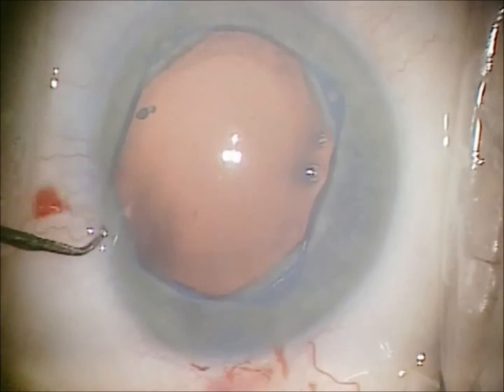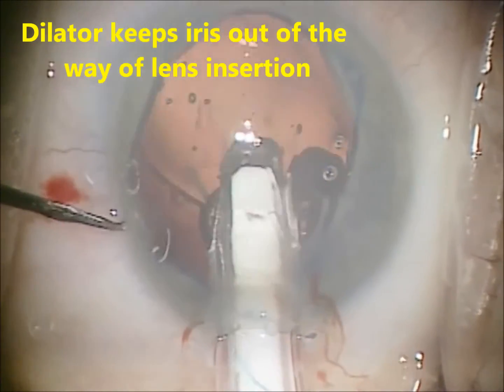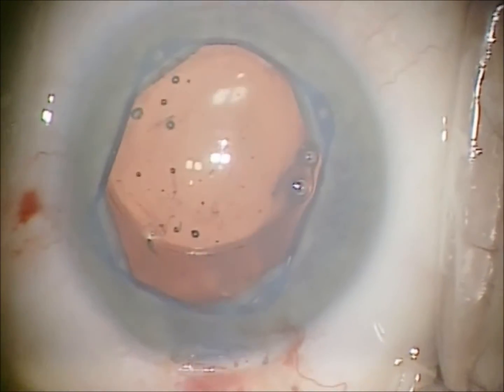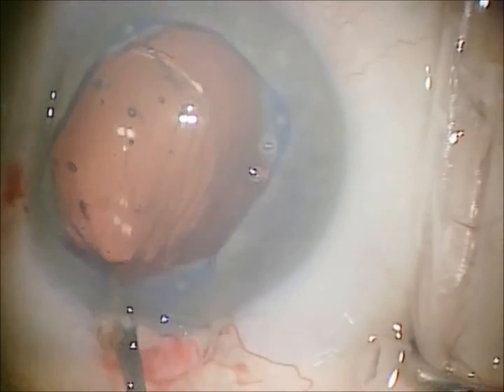Lens insertion again is above the iris — you're not going to engage the iris with it. It just gives you a nice, simple injection of your lens, and then removal is quite easy.